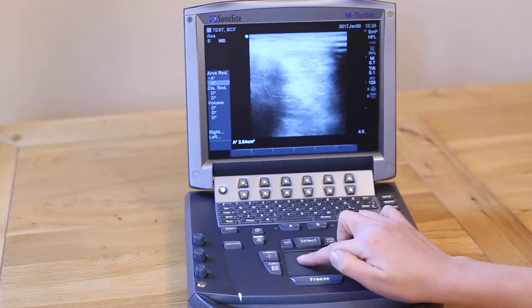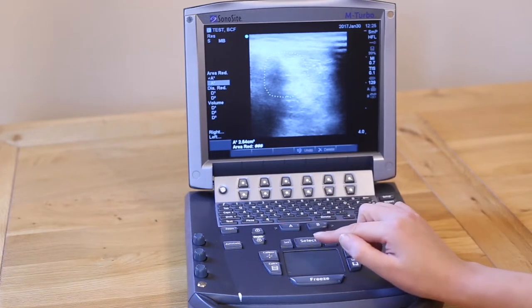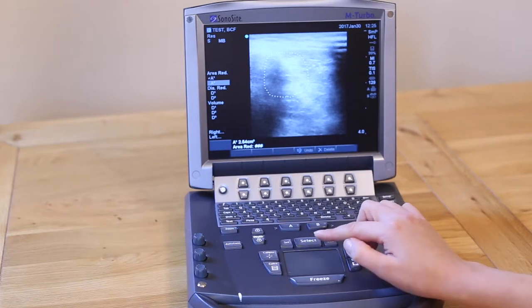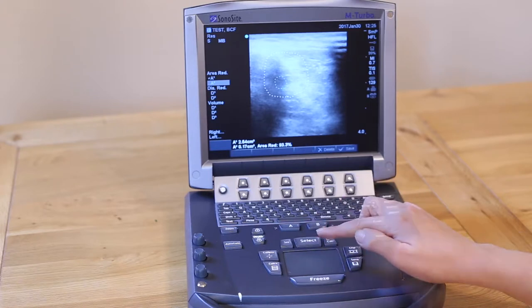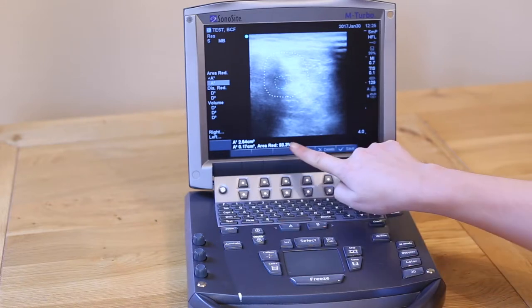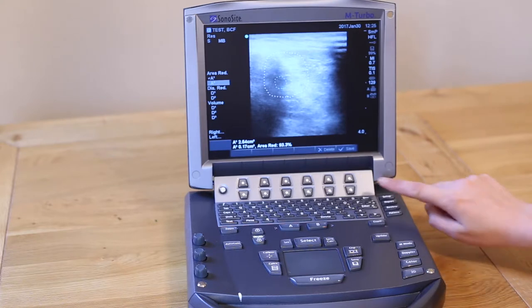Move down to Area 2 and press Select. Again, press Select to place your first caliper. Trace your lesion and press Select to place the second caliper. At the bottom of the screen, you will see the area of both traced areas and the percentage reduction between the first one and the second one. Then you can subtract the area reduction number from 100 to give you the percentage of the tendon which is damaged. You can delete each measurement one by one if you've made a mistake by pressing the second soft key from the right.